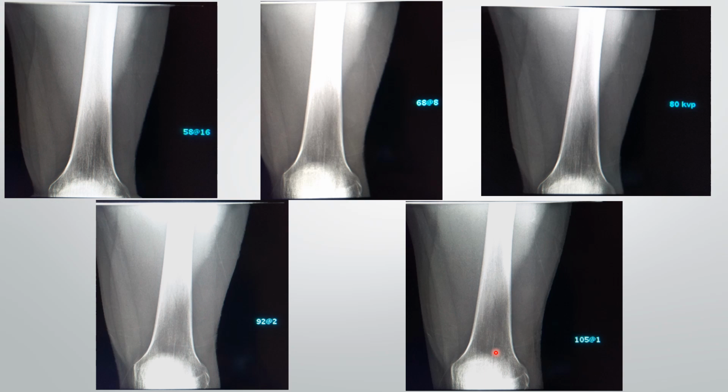So you can go ahead and look at these images and you can decide what's happening here. There's many different factors at play, of course, when we're taking an image, and we need to take all those into consideration: the patient dose, the look of the image, and all these things.